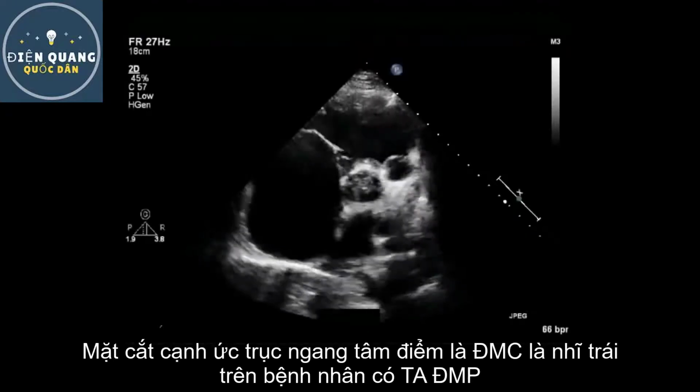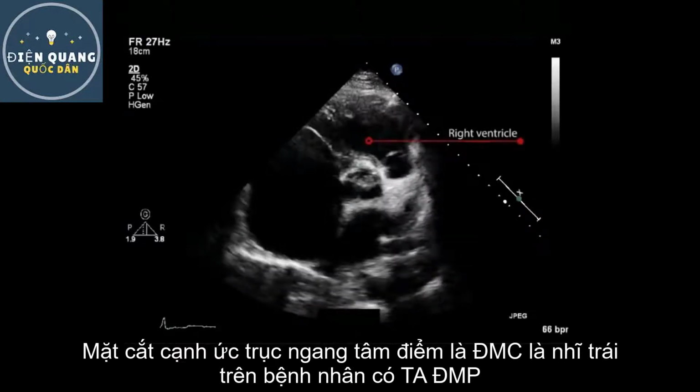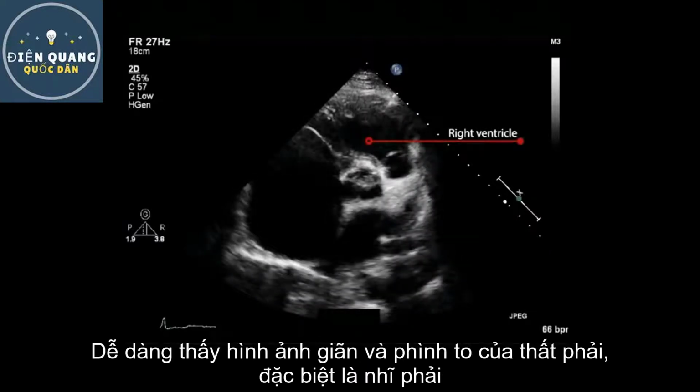In this patient with pulmonary hypertension, the parasternal short-axis view of the aorta and the left atrium clearly shows right atrial and ventricular dilatation and right ventricular hypertrophy.